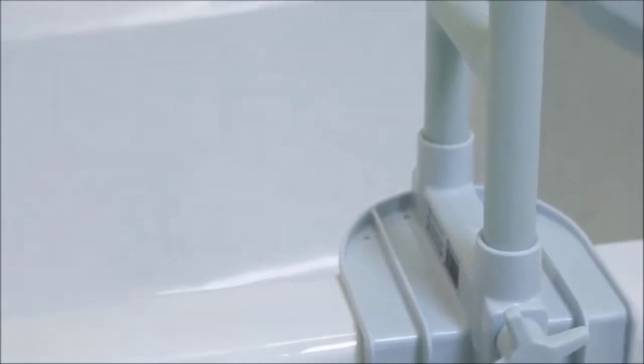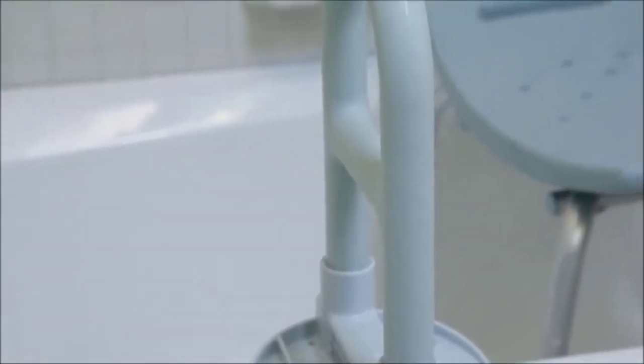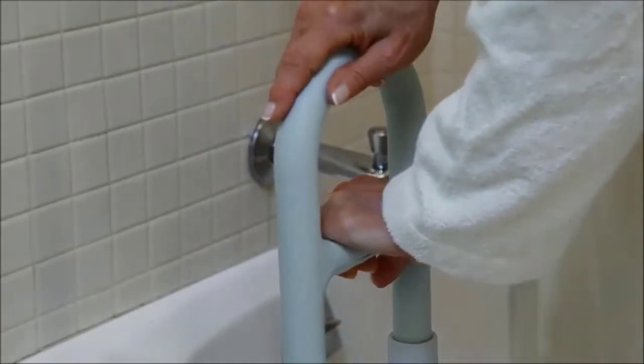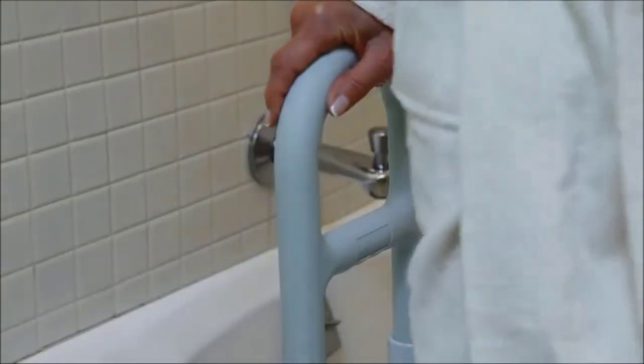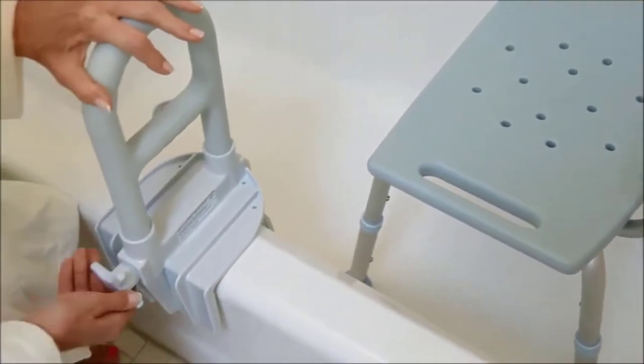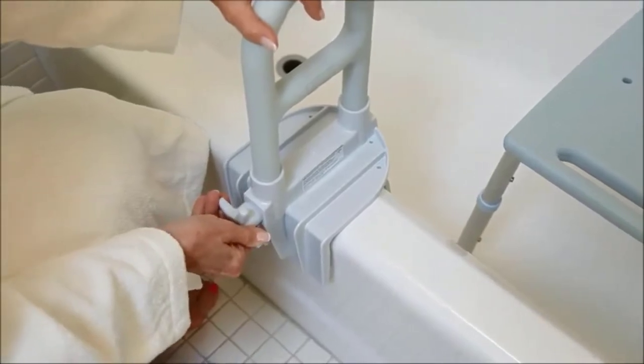The bathtub safety grab bar clamps directly onto the tub wall to help make entry and exit safer. Two hand positions offer maximum flexibility and safety. It attaches securely to tubs with walls up to 6¼ inches and supports up to 250 pounds.